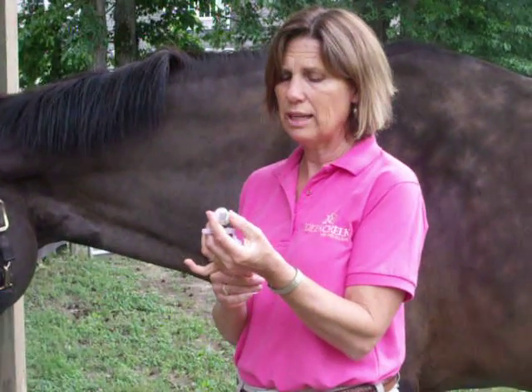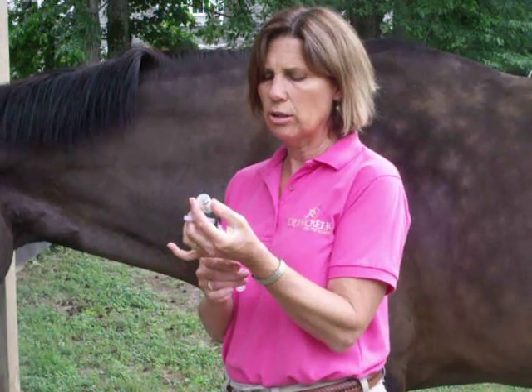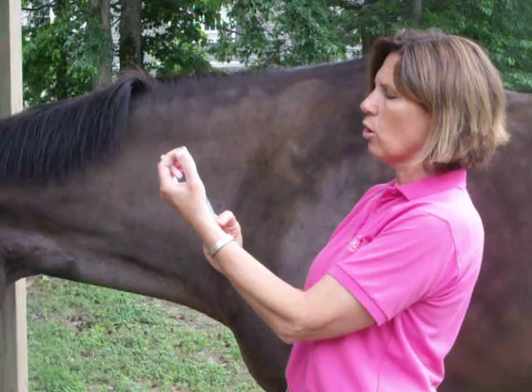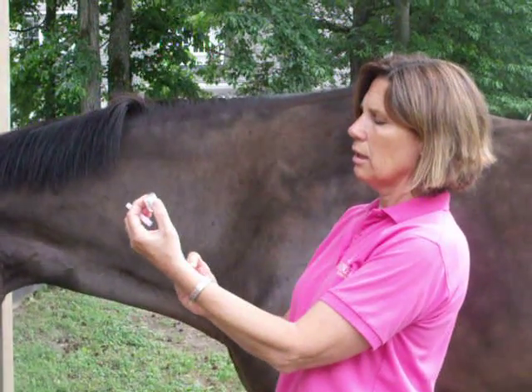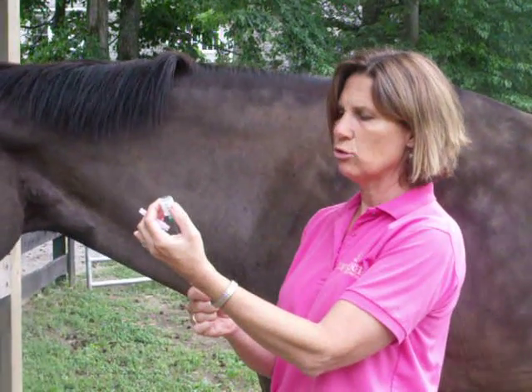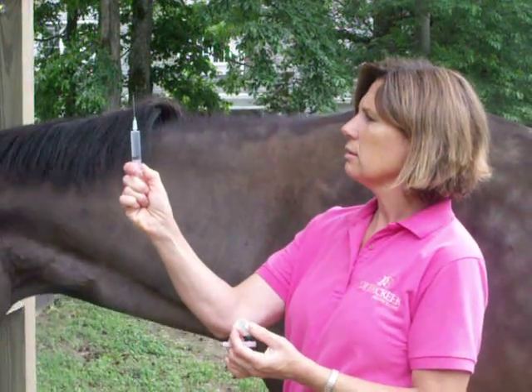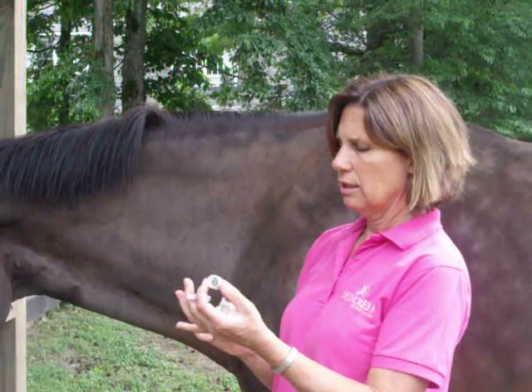We're going to demonstrate how to give an IM injection. The first thing you want to do is draw air into your syringe and then put it into your container that you're trying to draw out of, to make it easier to draw. This is an Adequan injection, which is given intramuscularly in the horse. Be careful — you want to depress the plunger so that there's no air in the syringe.